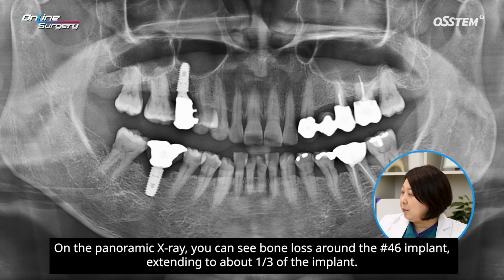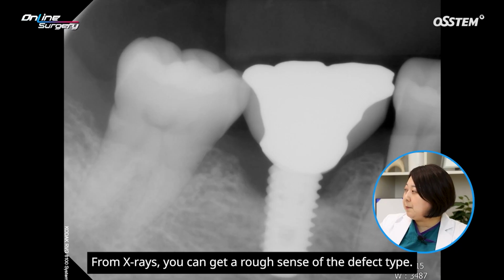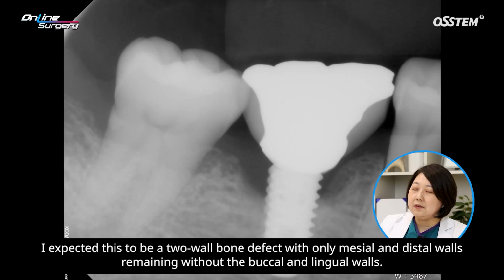On the panoramic X-ray, you can see bone loss around the number 46 implant, extending to about 1/3 of the implant. On the periapical X-ray, bone loss is even more prominent. From X-rays, you can get a rough sense of the defect type. I expected this to be a two-wall bone defect, with only mesial and distal walls remaining without the buccal and lingual walls.